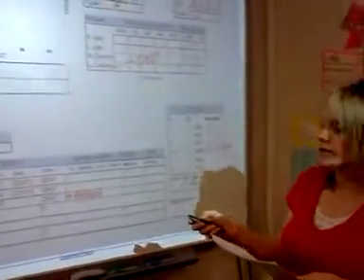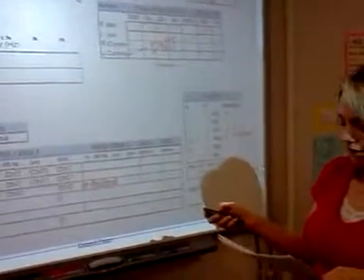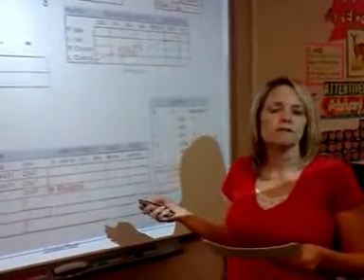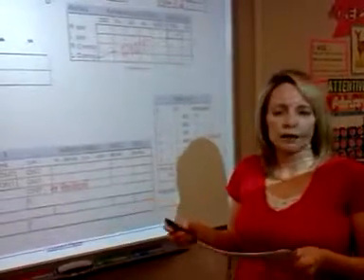The result is measured, or is presented, in a percentage. The speech recognition test is a test that tells us the lowest intensity level, measured in decibels, at which a person can correctly identify 50% of common two-syllable words such as airplane and baseball. These two-syllable words are also called spondees.